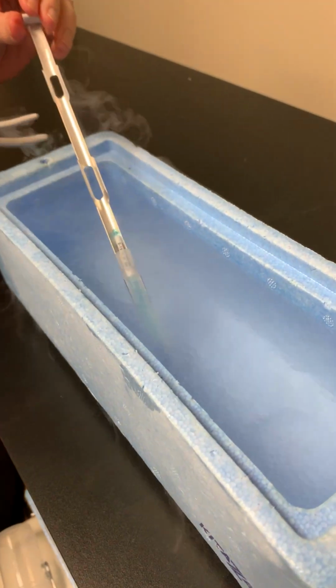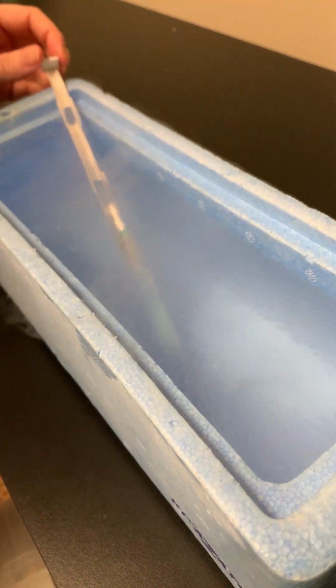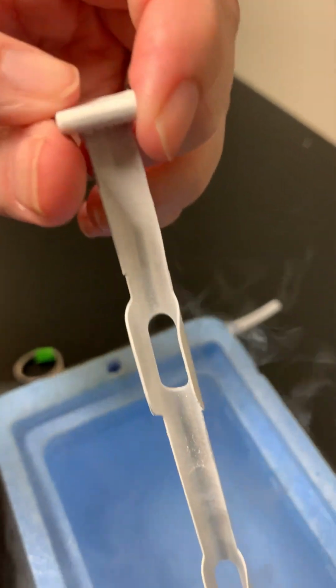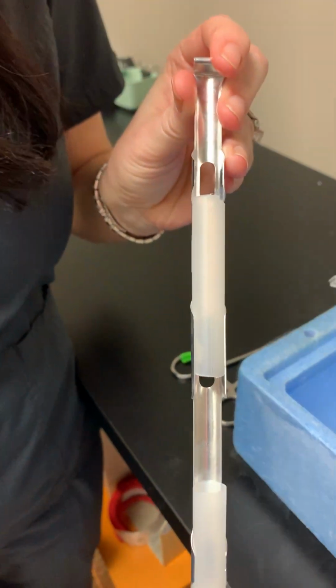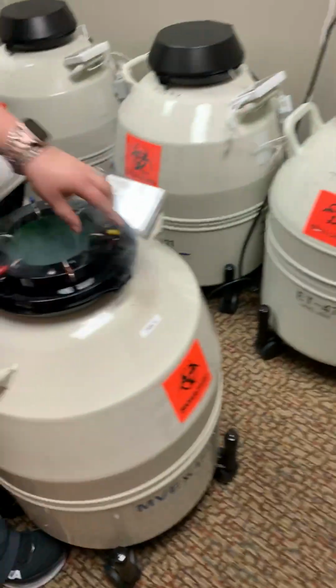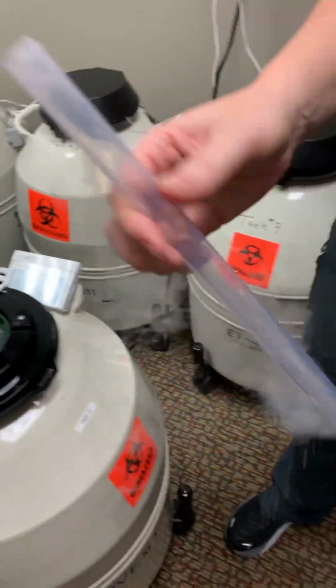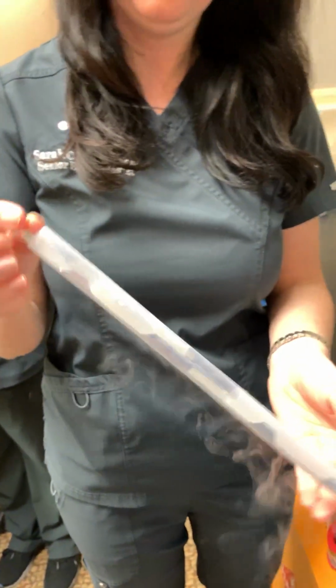Do they ever fall out? They do not, because they are in these, so they go into this, then we have something that snaps on top of it. We have another device that'll snap on top of that, and then we slide them into giant sheaths, and then they're blocked in by these labeling tops here, so that this would normally have a patient name on the top of it. And then we snap it in like this up top. Do you want to pull one of the sheaths out of there? Yes. And then it slides into this right here. It's cold. Wow. Yeah. That holds it all together.